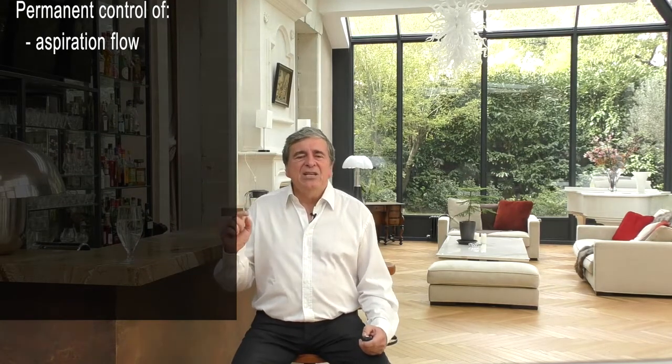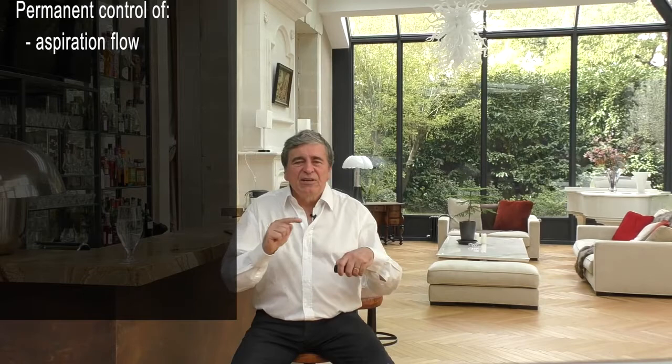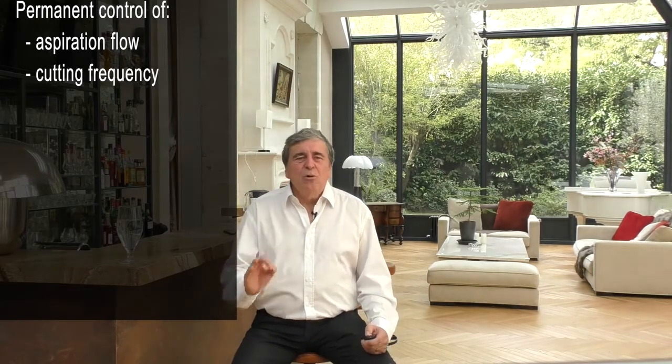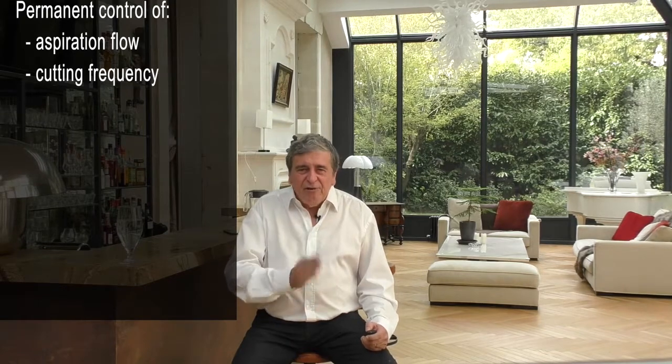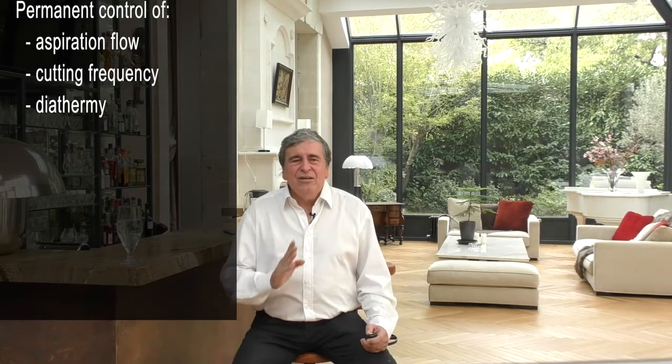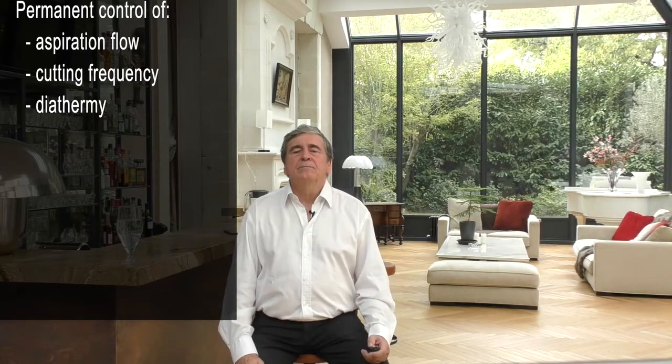What is needed? There is a need at all times to precisely control the amount of fluid entering the vitrectomy, the phaco or the posterior phaco handpiece. To precisely control the vitrectomy cutting frequency and ultrasound efficiency, and to precisely control the power of the diathermy.